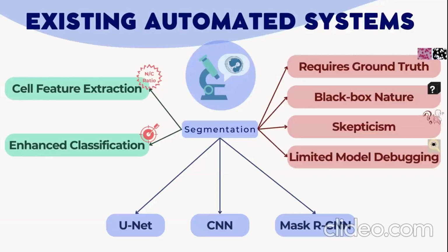Additionally, these models often operate as black boxes, leading to skepticism among clinicians who are hesitant to trust and adopt these systems. This lack of transparency not only affects clinicians' acceptance but also impedes our ability to effectively debug and improve the internal workings of the model.